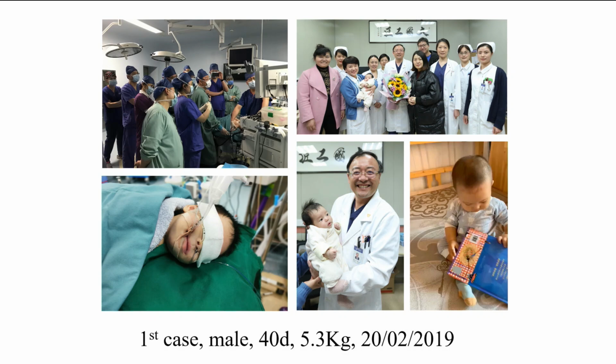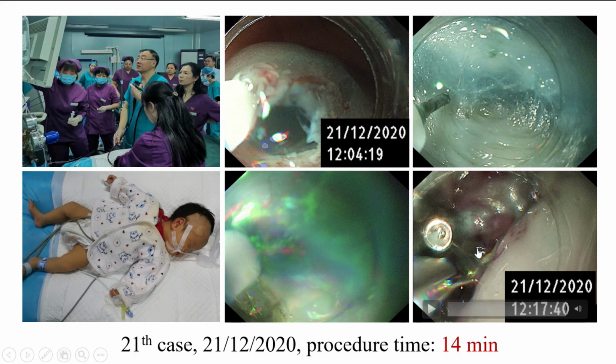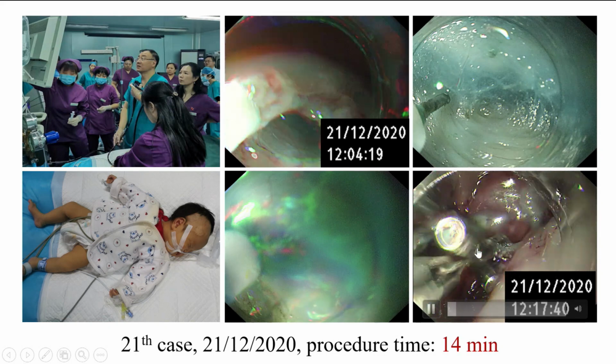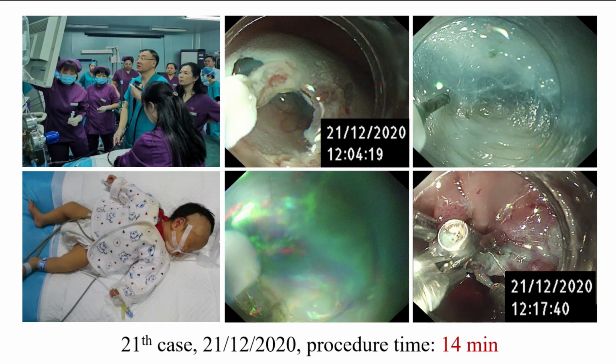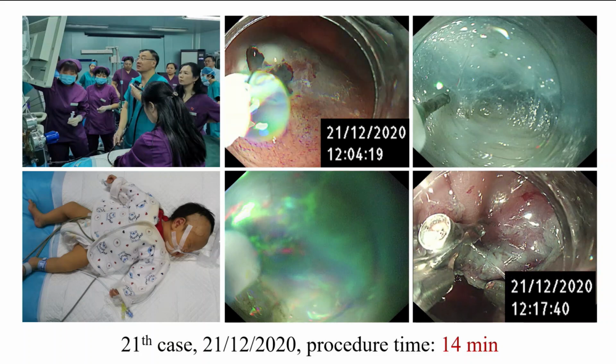The patient was 40 days old, and the body weight was only 5.3 kilograms. And this is another case where we performed such a procedure. The procedure time was only 14 minutes. So I think such a procedure in young infants is also very easy.